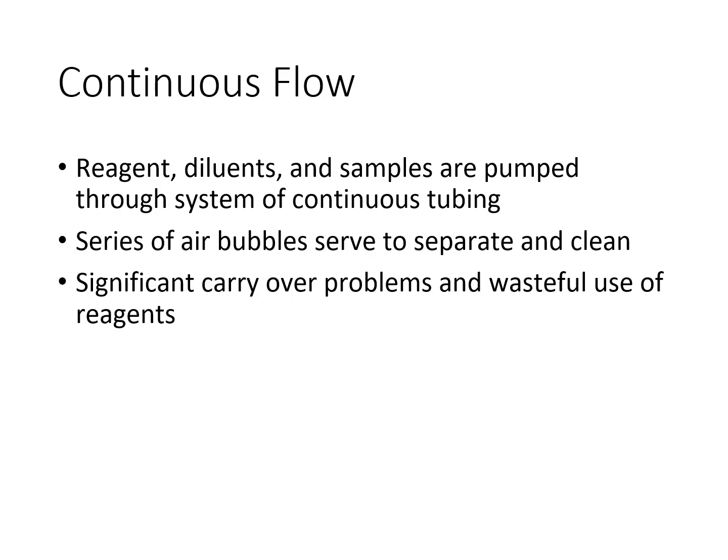So some history behind continuous flow analyzers. They were among the first automated analyzers, such as the Technicon system that was developed in the 50s and 60s. Their development paved the way for newer, more efficient automation techniques like the discrete analysis.